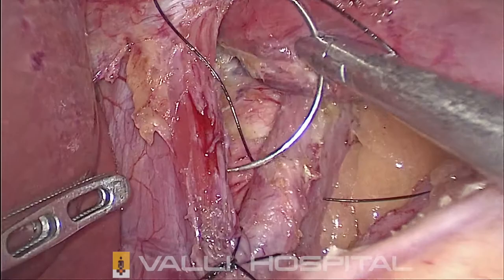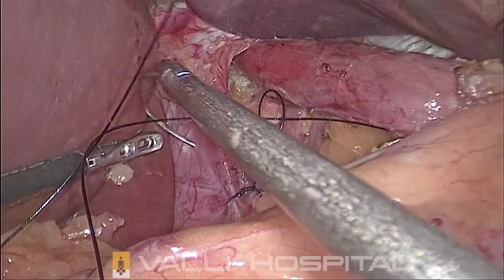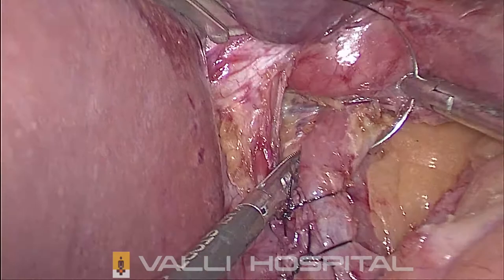across both. No. Take a good chunk. You should not take a smaller bite. If you take a smaller bite, it will cut through. You need to be careful about the aorta. This is the next stitch.